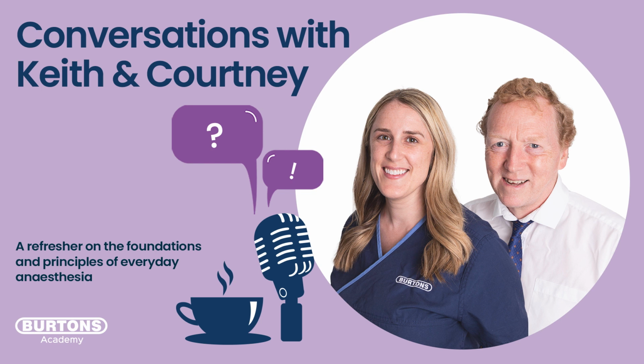I seem to remember being in practice having quite a few different ventilators where I was fortunate enough to work. And there were 2 different types of cycling methods that I thought we could really simply clarify. Cycling is when we switch over from inspiration ending to expiration beginning. You talked about the SAV being pressure cycling. So you set the pressure and it works its way up to that pressure set, 10 centimeters of water. It delivers the gas flow and the volume to 10 centimeters of water, and then it goes, now we'll just stop. Then we have the other method of cycling that's really common in practice, which is volume.